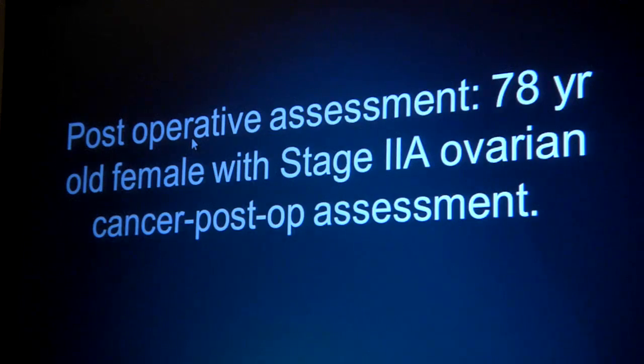And again, diffusion-weighted image, we then calculate the diffusion values for each individual pixel and display them in grayscale format. And here we can see that if you meticulously compare side by side, slice by slice, that this area of decreased or restricted diffusion corresponds to an area of viable tumor.